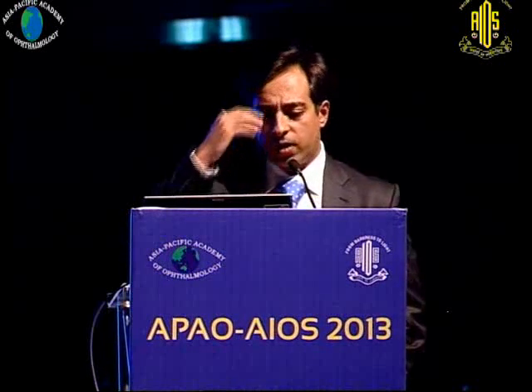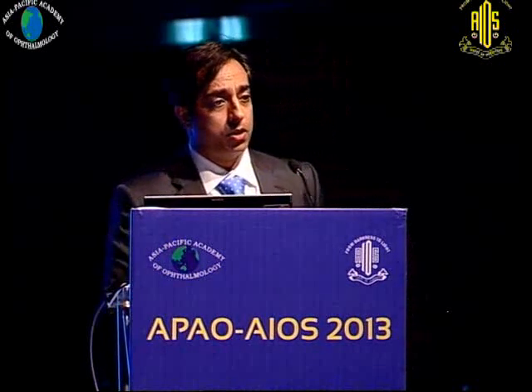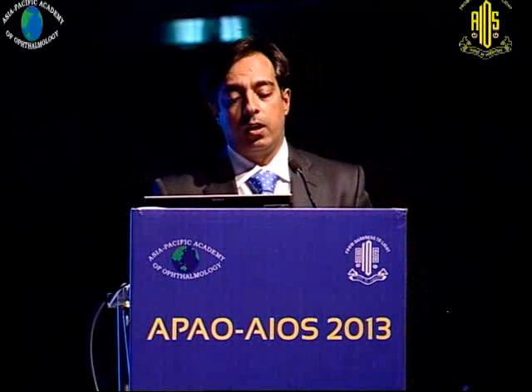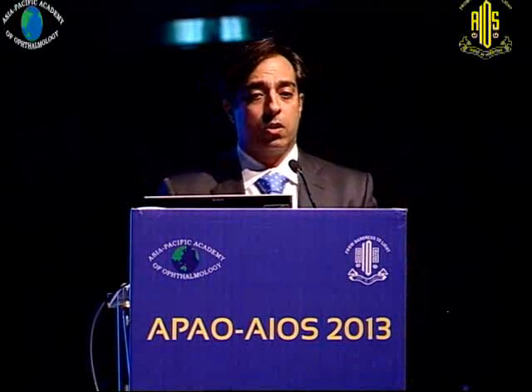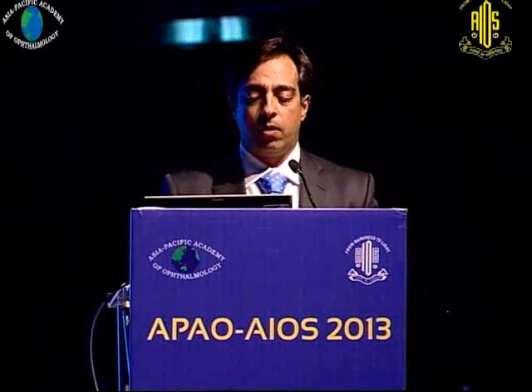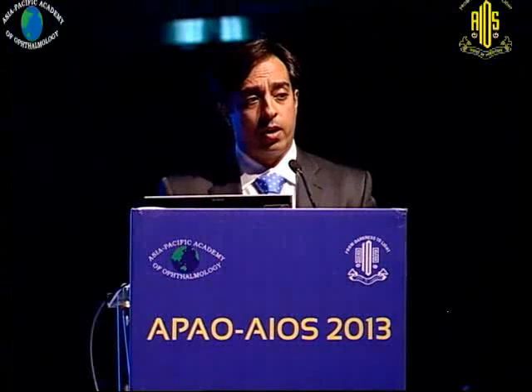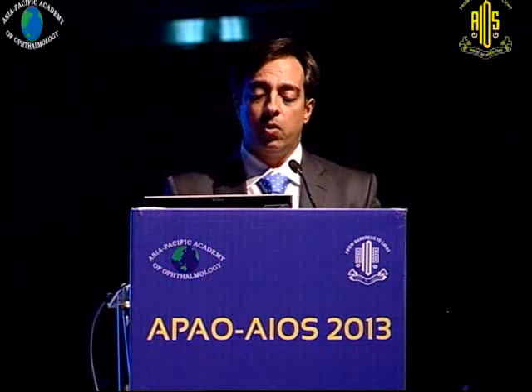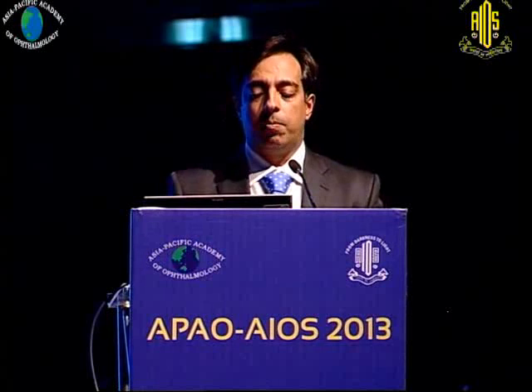Now if there's a vascular entity, you might have proliferations and some vascular adhesions. You need to be careful, because it can result in a lot of bleeding, because all the vasculature is coming from the retina and the choroid and is attaching as a scaffold, forming proliferation. So here you need to be a bit gentler, keep assessing.